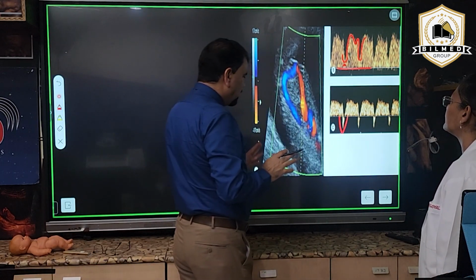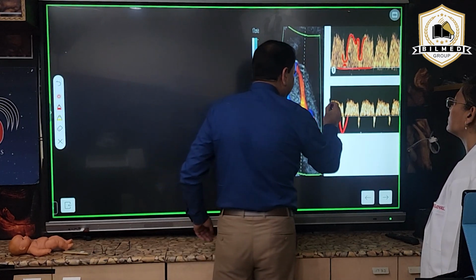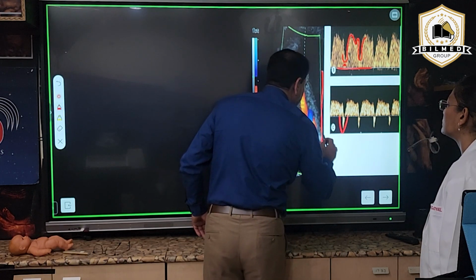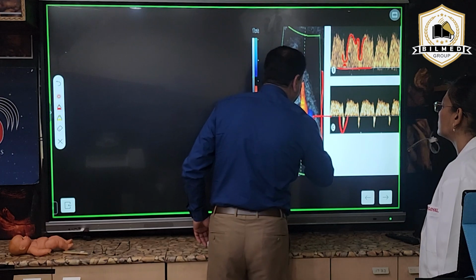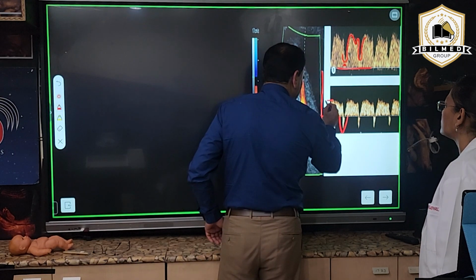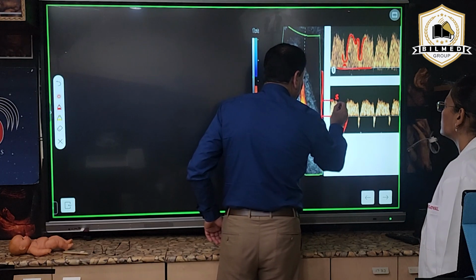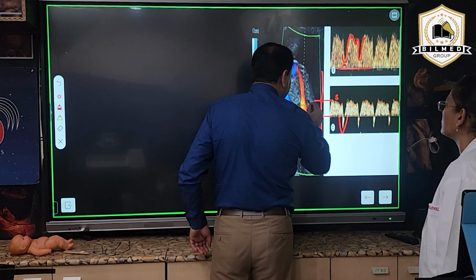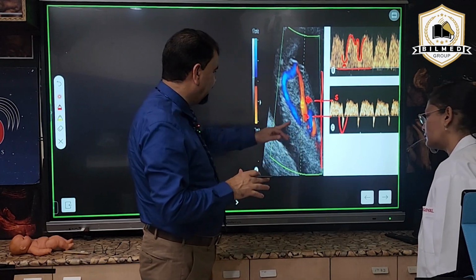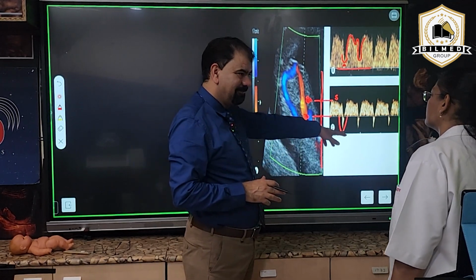Right? Now, try to understand, I am having a scale over here. 0 will be written over here. This is S over here. Okay? This is S. This S has to correspond to more than or equal to 80. Somewhere at 80, if it is true DV.